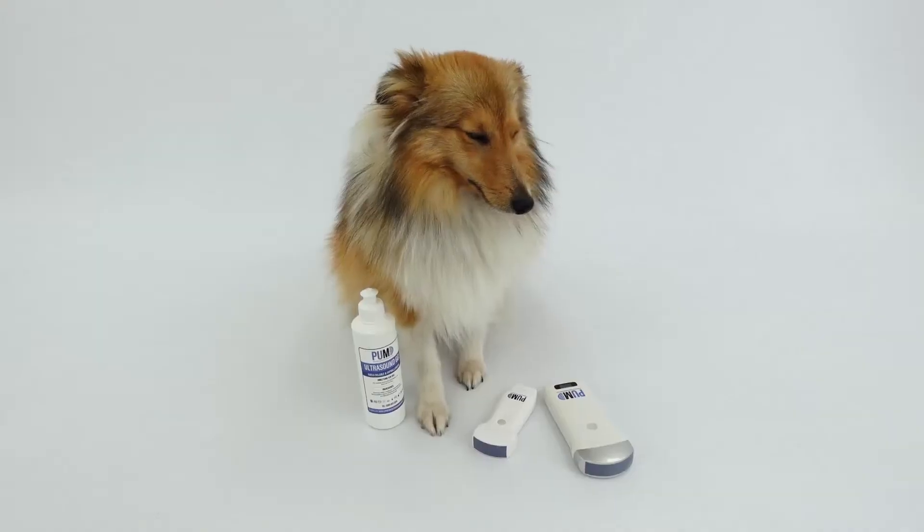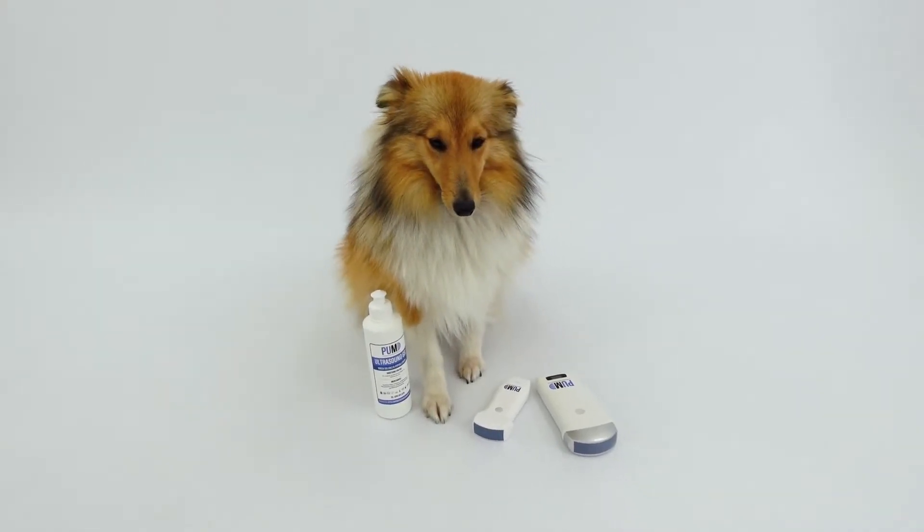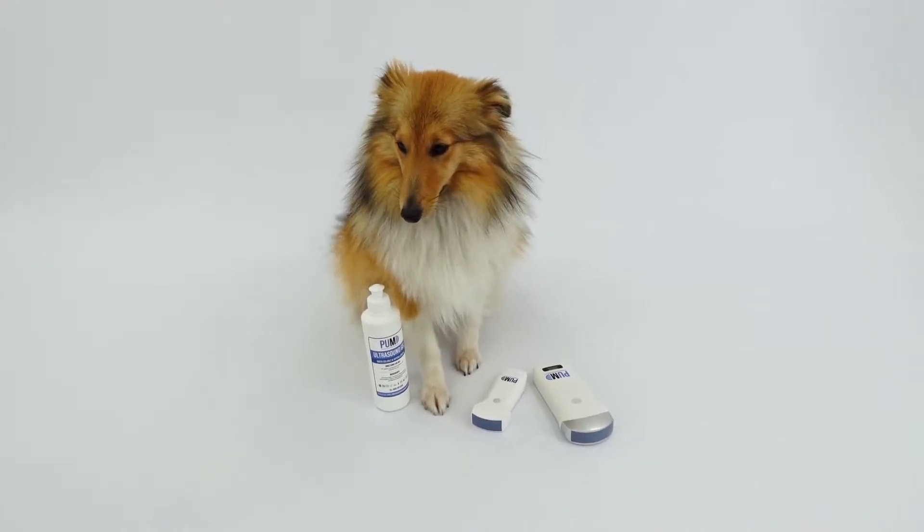Wireless ultrasound probes like these have been in the market for a long time, but it's only relatively recently that image quality has got good enough and it's worth vet practices considering them. Cosmetically, all wireless probes look very similar and it can be difficult to know how to choose between them when the price point can often vary quite considerably.